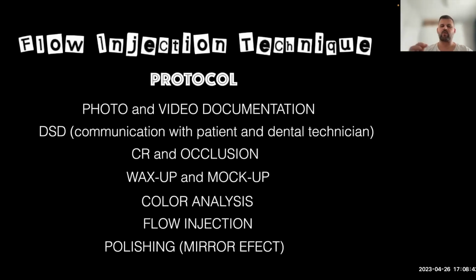Of course, today I don't want to talk about photo and video documentation, DSD, and how to plan and design the smile, because we were talking about this last time. Now I would like to start from centric and occlusion.